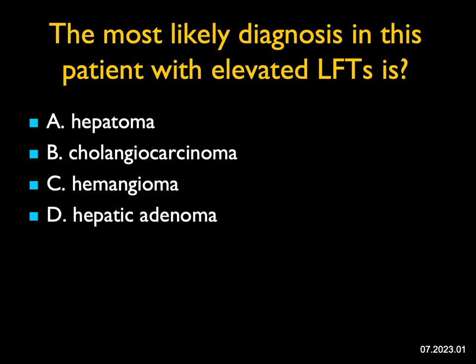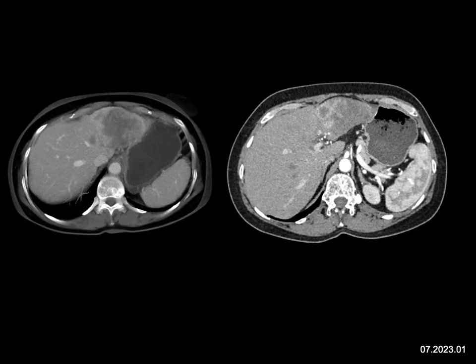The most likely diagnosis in this patient with elevated LFTs is — well, what do I see? I see a mass in the left lobe of the liver. It's a little better seen on the venous than the arterial phase. It's slightly vascular but not very vascular. It looks like it involves the left portal vein, but there's no duct dilatation and it's a solitary mass.